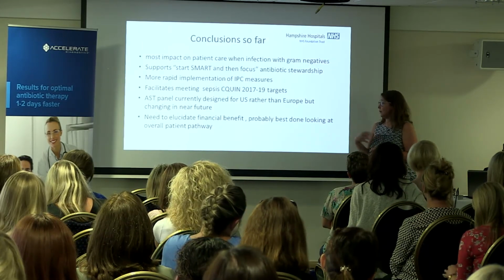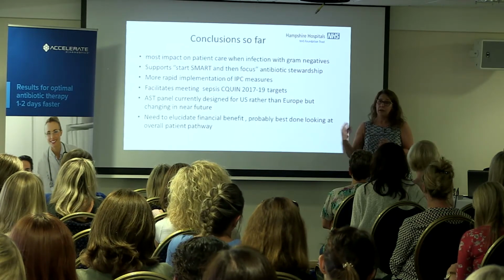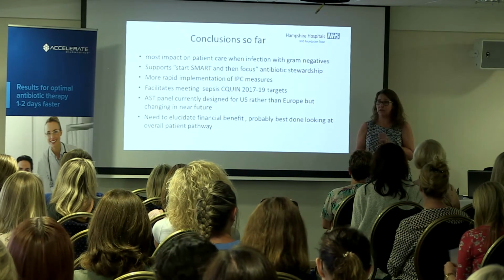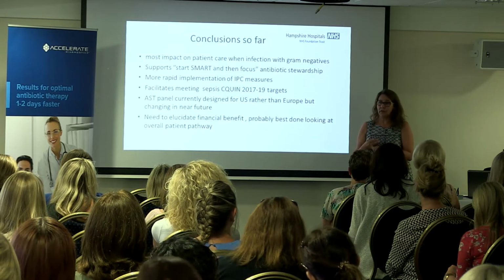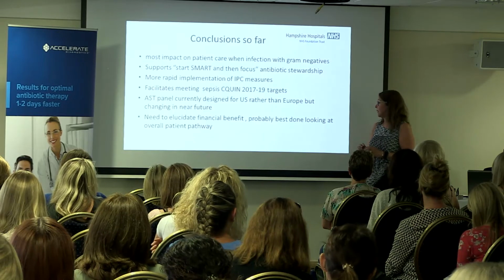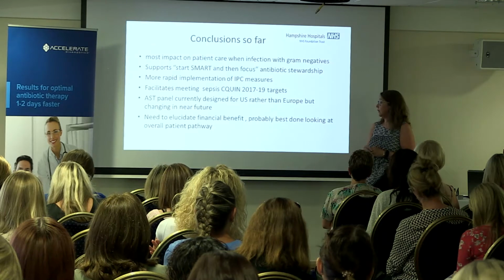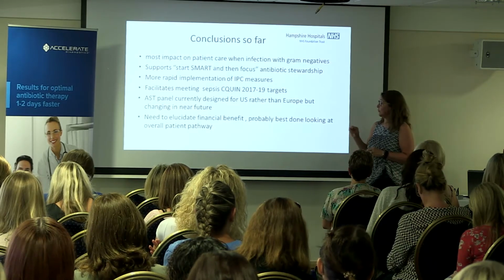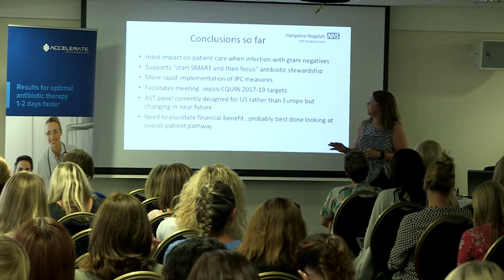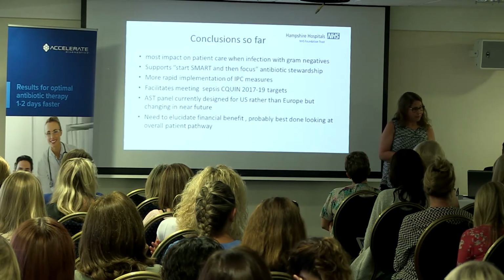So the problem for us at the moment is how do we elucidate the financial benefit? It is an expensive test to do in the laboratory, but if you look at the overall patient pathway and the amount of money that you might save because of reduced time in ITU, or fewer broad-spectrum antibiotics and more narrow-spectrum antibiotics, isolating patients more quickly to prevent spread of infections. So we're working quite hard on that now so that I can take a business case to board to get approval in these difficult financial times to have it put in the department.